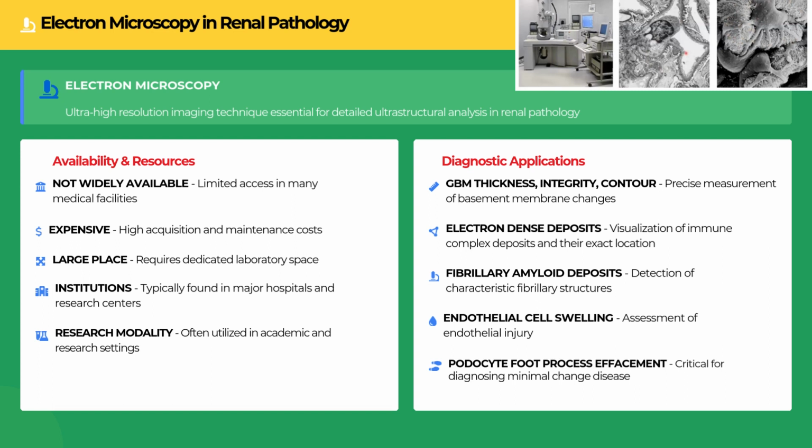and the image is viewed from the bottom, similar to optical microscopy, but images are usually viewed digitally on a monitor screen like this. EM is an expensive technique and is not widely available in many countries with cost-effective strategies like most European countries.